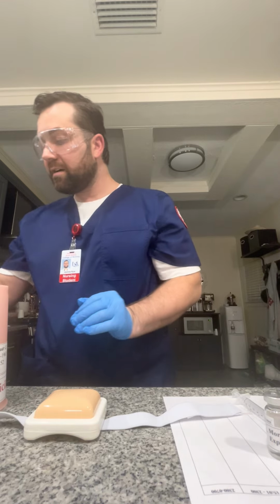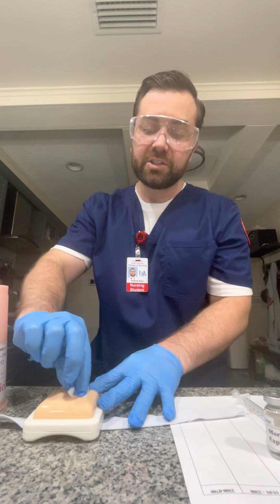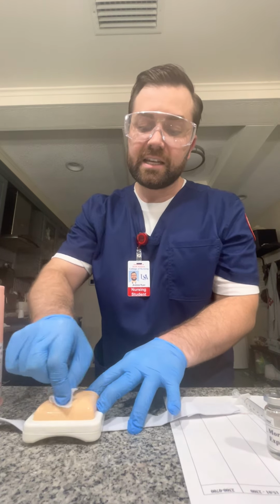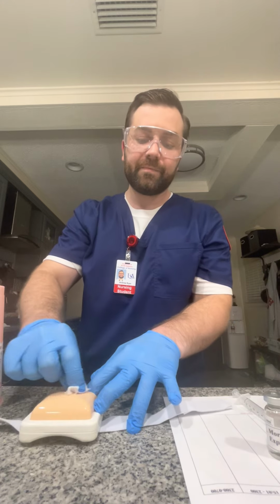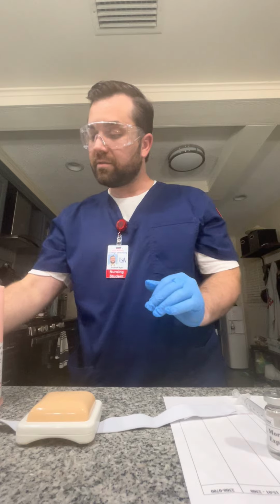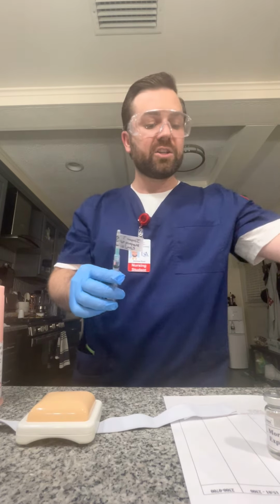So now that you're comfortable, I'm going to get a new alcohol pad, and I'm just going to clean in a circular motion, making sure that the skin as well is in good condition. And all right, it is, and I can throw this away. All right, so your site is clean, and I will be getting my sharps container.